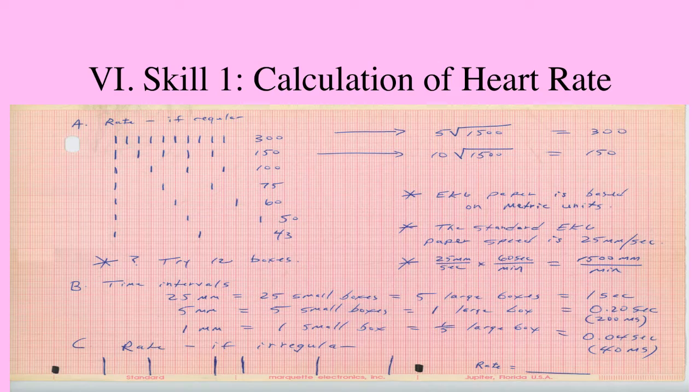I've done some studies where we tried to look at the accuracy of heart rate taking. It's been an area of interest. When we do those studies, our comparison is always to the standard EKG, because that's a definite heart rate. So this is a slide that shows an EKG, and I've just written on this. The writing is probably not perfect, but bear with it.